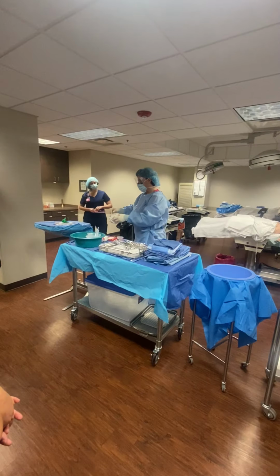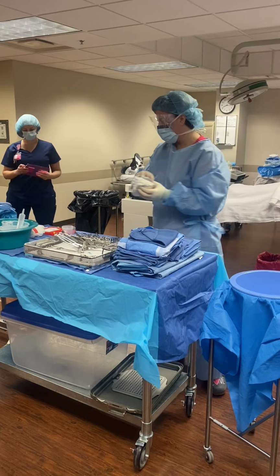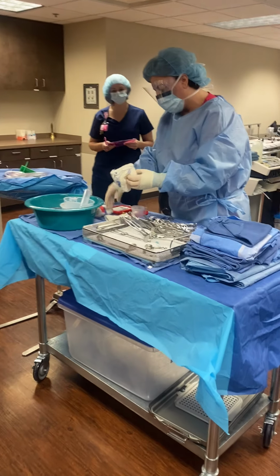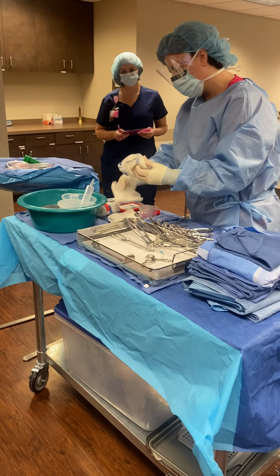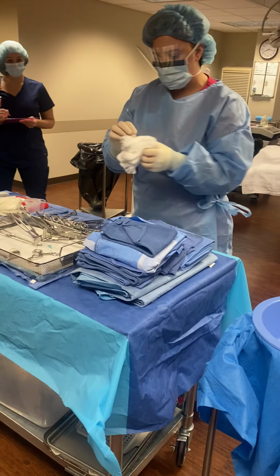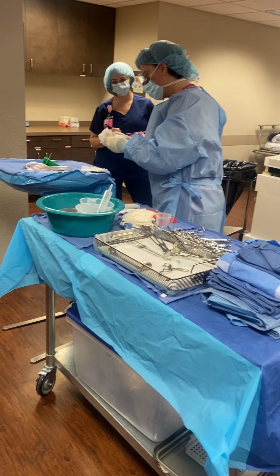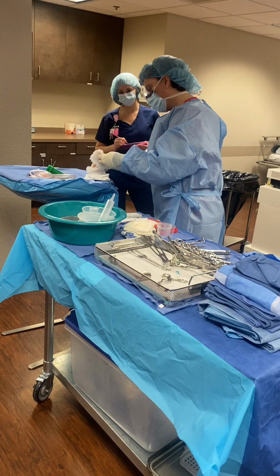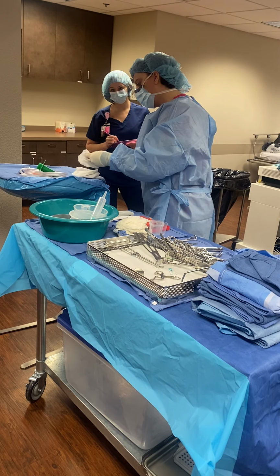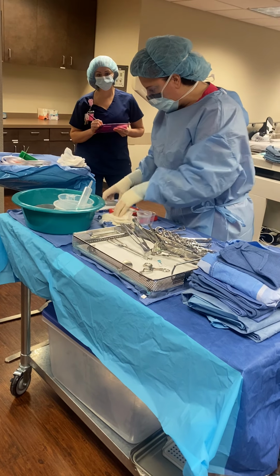Oh, I almost forgot that this happens in the real world. Okay, left. One, 2, 3, 4, 5. Right. Raytex. I got 1, 2, 3, 4, 5, 6, 7, 8, 9, and 10. 10 right there. So that should be all my sponges.